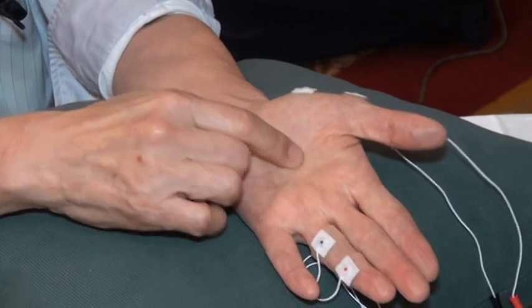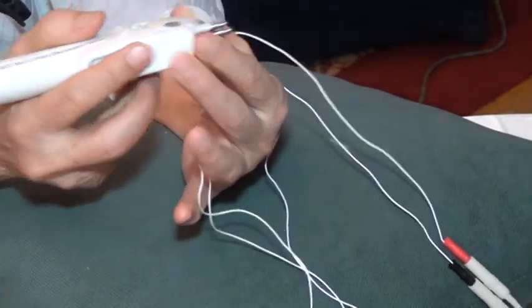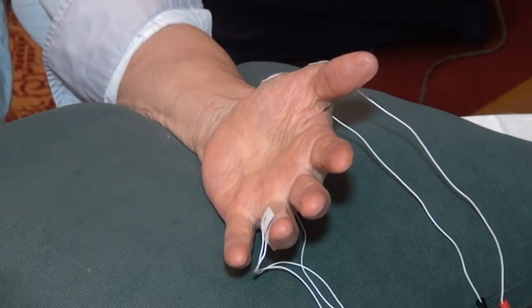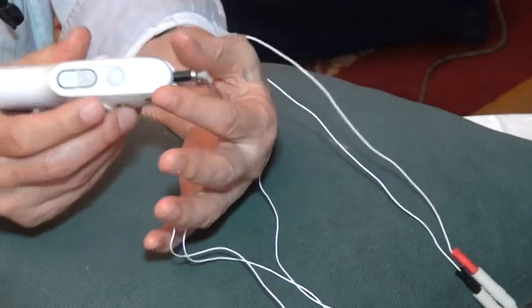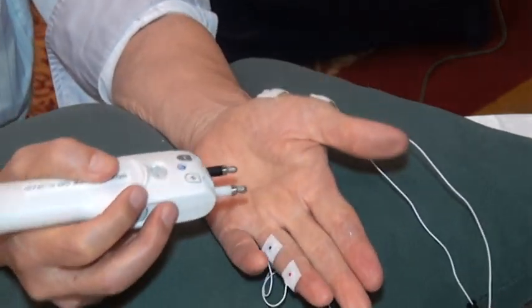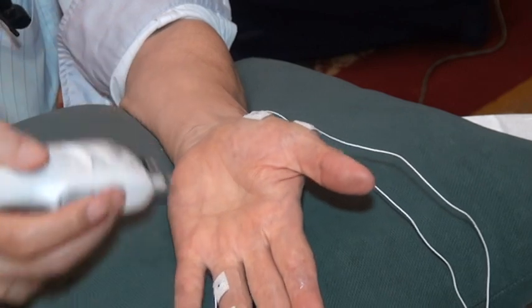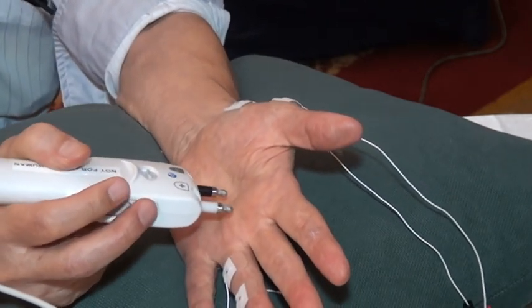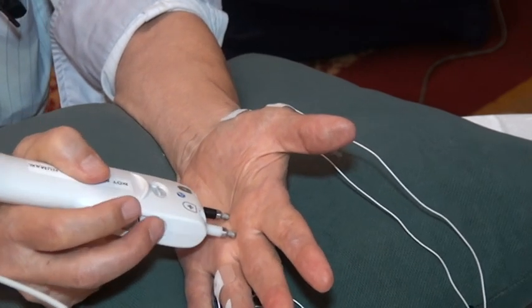But now let me show you, before I go further, how the thumb is stimulated. The median nerve is stimulated at the palm, which is not very easy. Sometimes, unless you know what you're doing, it's not an easy thing to do. But you learn it. So again, the pickup electrode is the same. I'm going to stimulate. Give me about 20, 25 to speed up. Okay. So I'm going to stimulate here.